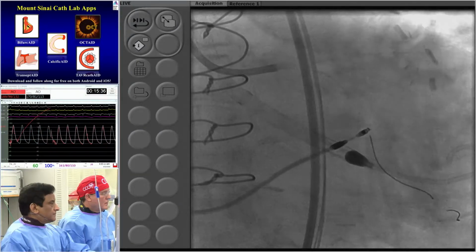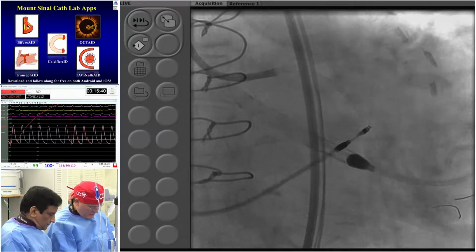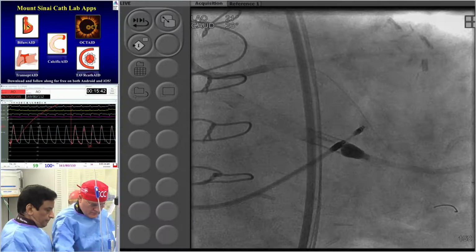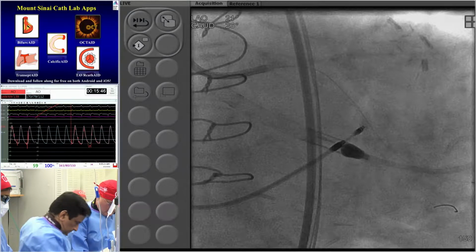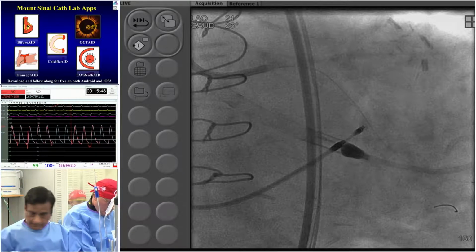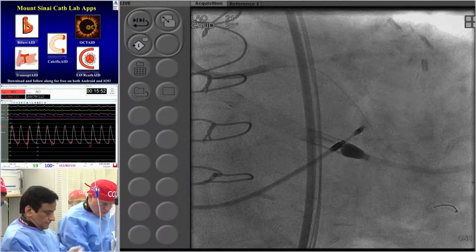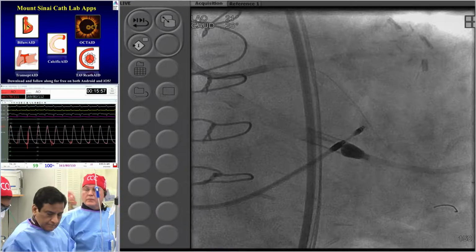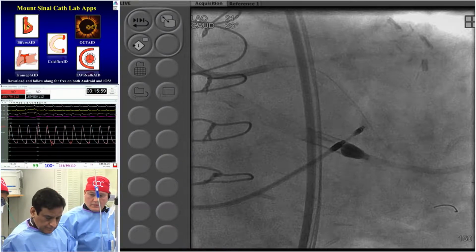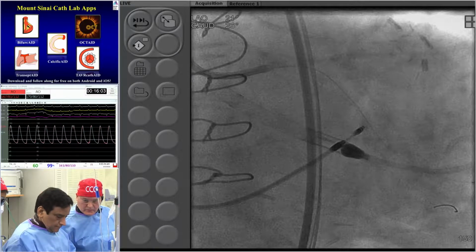Would this be a good candidate for a shock wave, Roxana, for the left main? I'd love to hear. So three questions. For the circ lesion, you don't think it's calcified, so you'll be able to open it with a regular pre-dilatation balloon, I think. The question on the table here is rotoblator, shockwave, orbital atherectomy. Why did you choose rotoblator over these two other techniques, Dr. Sharma?